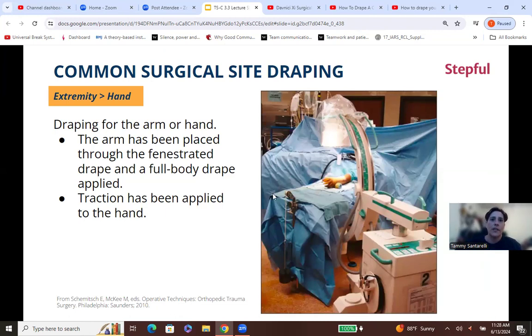The surgeon would be sitting over here. We may or may not be over here and have to move in and out of the way when we bring C-arm in. If the C-arm is going to be standing right here the whole time, then we'll either be on this side or right next to the surgeon, helping with instrumentation and holding instruments.